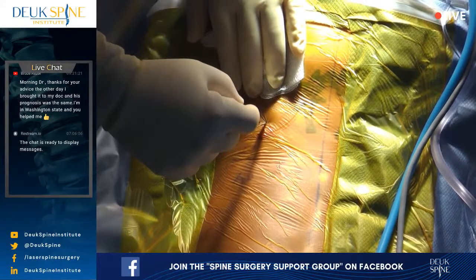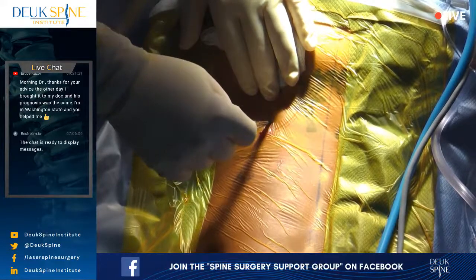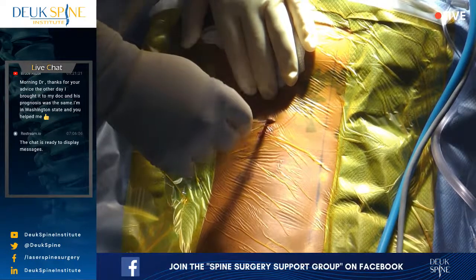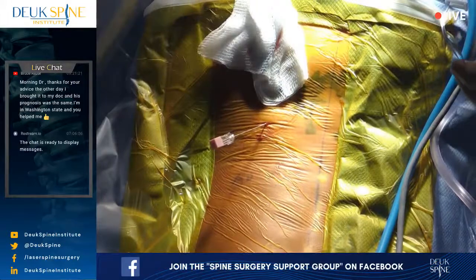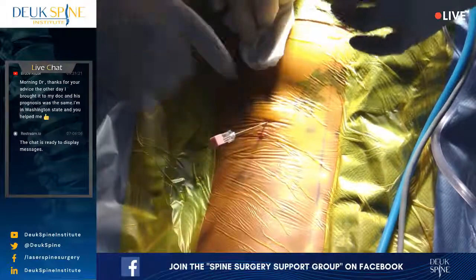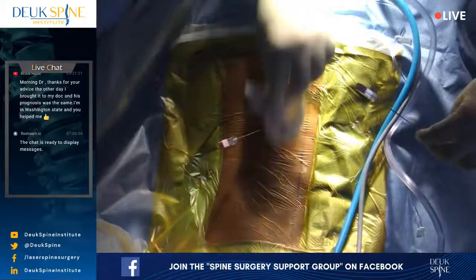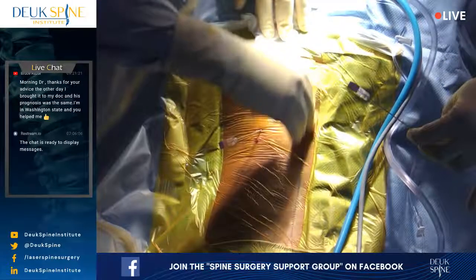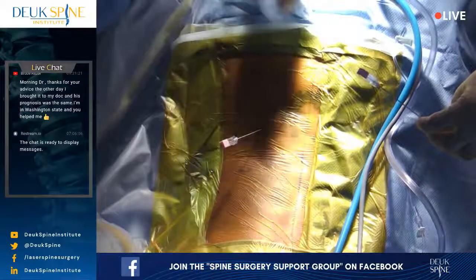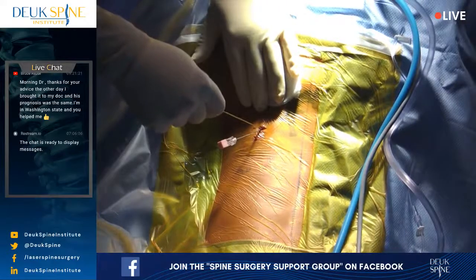Clearly, that's going to be one of your bad discs, okay? So now that we have the L5-S1 accessed, we have an entry point or origin, and we have a destination. So we've connected the origin, which is here where I'm working, to the destination. Now, if you watch the surgery I did Tuesday, the fusion, we literally opened the patient's back from here to here, this whole incision, just to fix three discs, okay? And the whole first 2 hours of the surgery was just getting down to the spine. We call that the access. This has taken 5 minutes, maybe 10 minutes by the time I do both.